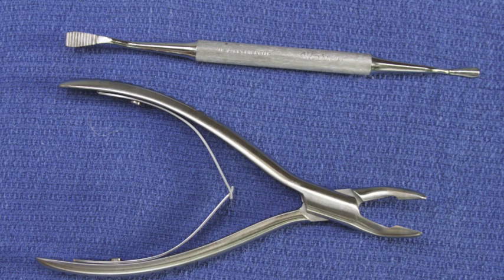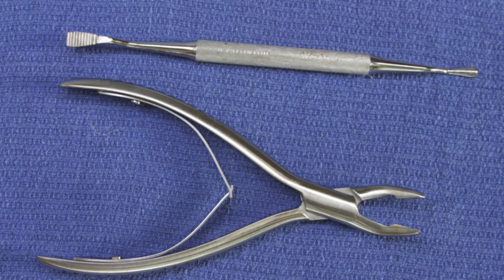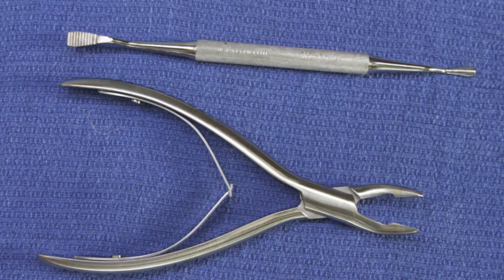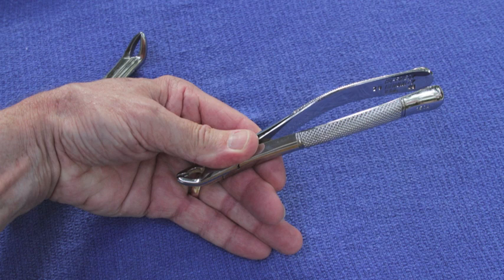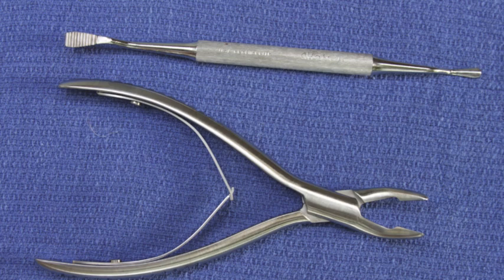One thing that you can notice about the rongeur right away are the springs found within the handles. This is so that when the surgeon squeezes the handles, as soon as pressure is relieved, it will open again. This is different than you will find on any other surgical instrument that has a handle, a hinge, and beaks. When it comes to handling these instruments, the hinge becomes a very important part for you, the dental assistant, because most often you will grasp the instrument by the beaks and the hinge. This will allow the surgeon to be able to grasp hold of the handle. Keep this in mind as we look at a variety of instruments that are constructed in a similar way.